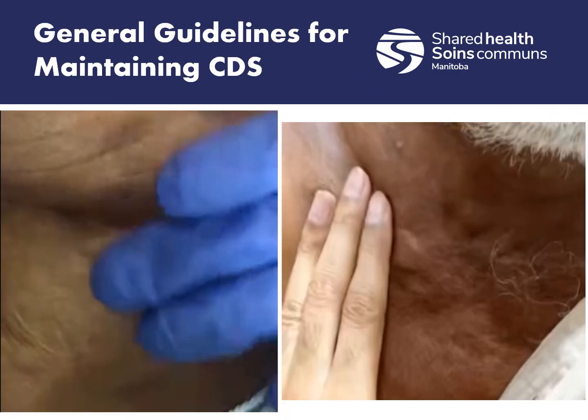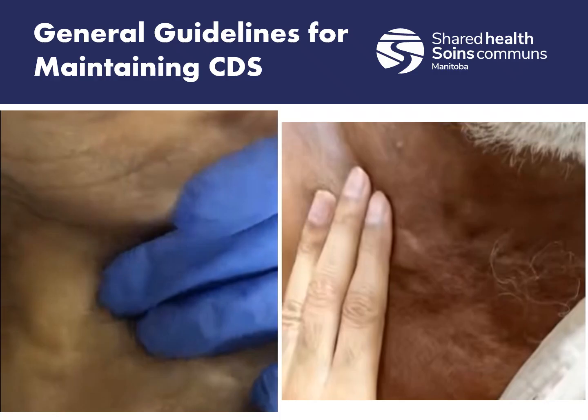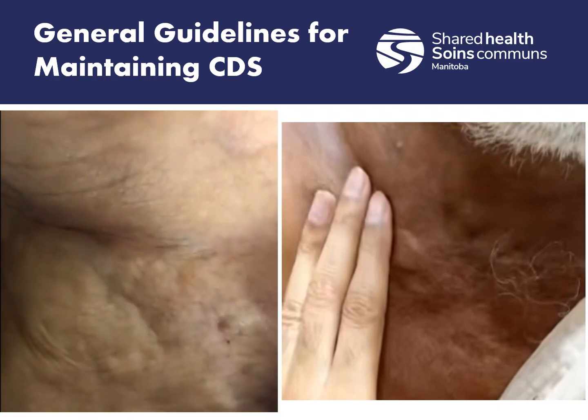Other things we want to look for if we've got a lot of air leak concerns, we can gently palpate the area around. I wouldn't recommend routinely doing this if there's no reason to. But if we're looking at a leak and we can't really find what it is, we could look around the area for some subcutaneous emphysema. So we might feel crepitus, as you can see here in this first one. So you get those bubbles forming underneath the skin.